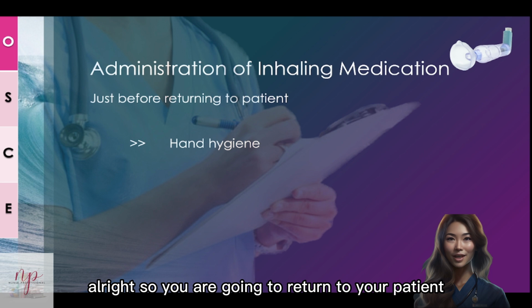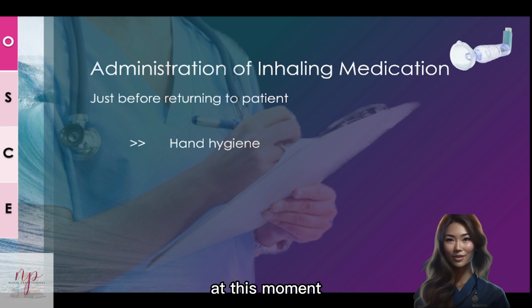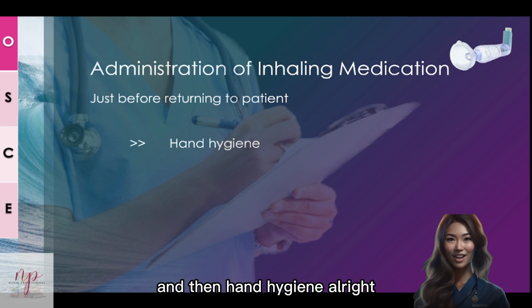Alright, so you are going to return to your patient because you have already gathered all your equipment. At this moment, remember to do hand hygiene. Remember, every time you approach the patient, and every time you leave the patient, you do hand hygiene. Every time you gather equipment and finish, do hand hygiene, alright?